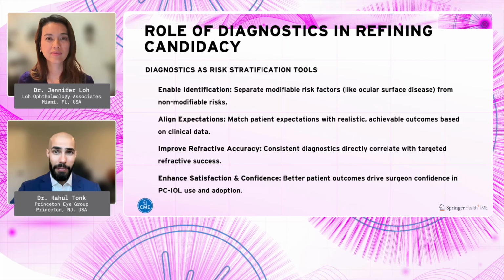One of my favorites, and what I do for every patient, is a screening placido disc topography. And that serves a dual benefit. It gives me first a qualitative idea of how the ocular surface is looking. Is the astigmatism regular or irregular? With irregular astigmatism, I want to look at the cornea and the tear film in a little bit more detail. And it also gives me a screening for astigmatism. Refractive astigmatism at the time of a cataract consult may be just a function of the lens.